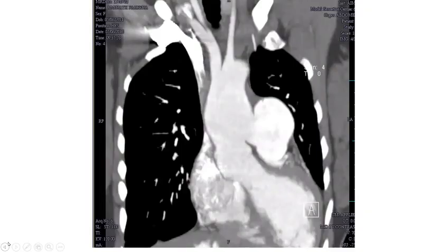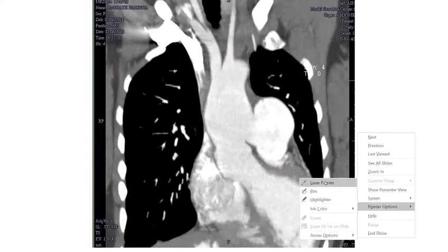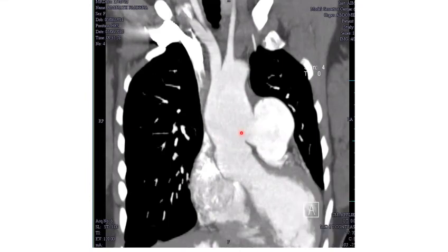And what is this? This is also a still film of the CT angio. What does this indicate? Maybe difficult. There is a communication here. Sir, from LV, aorta is arising. There is a communication. Aorta is arising from LV. What is this communication?